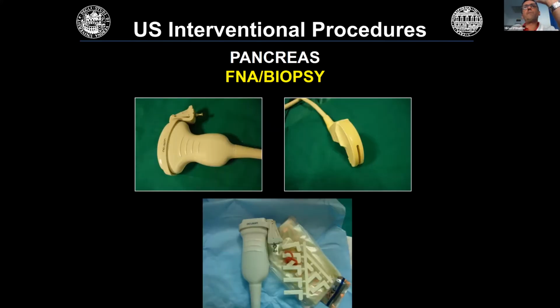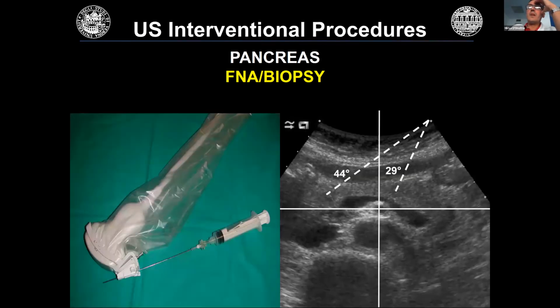Just to remind that we are using sterile devices, and we can have the guidance placed laterally to the probe or inside the probe, and we can reach the pancreas with different angles. The angle depends on the machine that we are using.